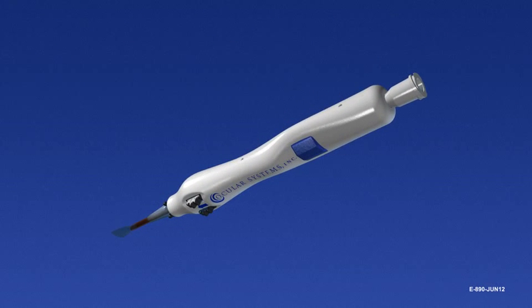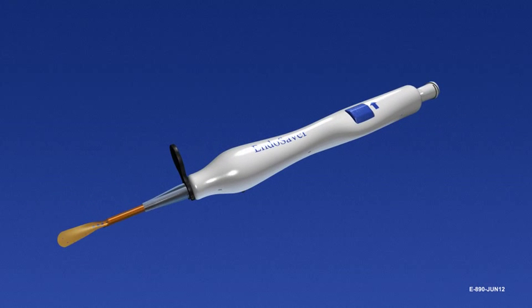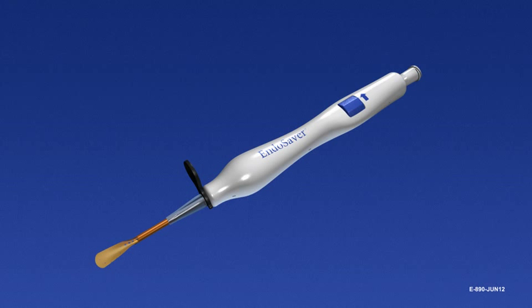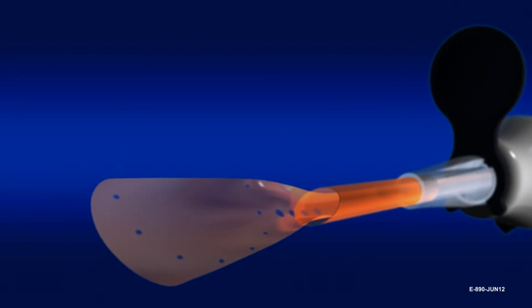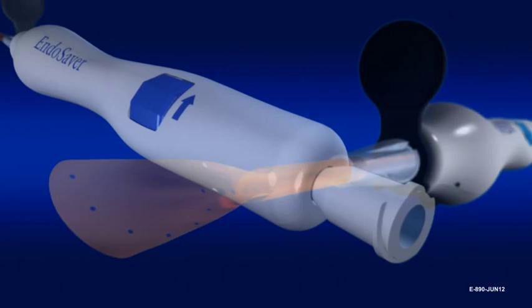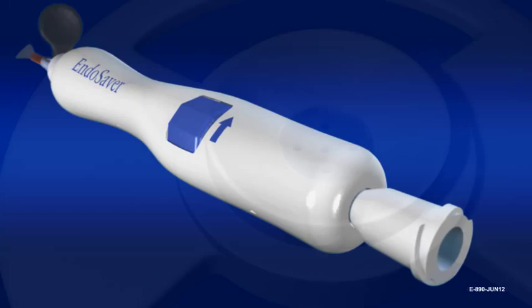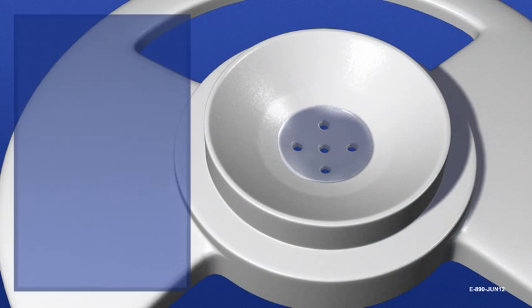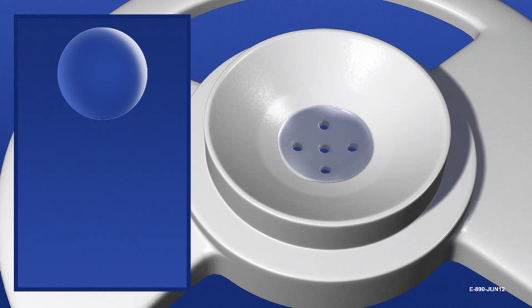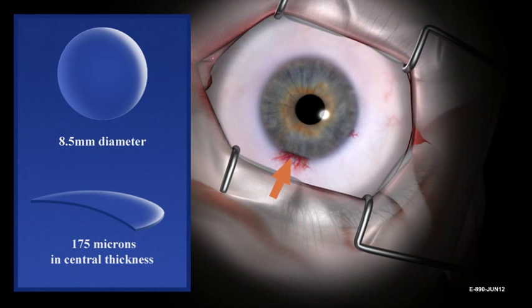The EndoSaver consists of the instrument's body, its internal mechanism, and carrier. It is a sterile, disposable, single-use-only device. When loaded with allograft tissue, rotated, and inserted into the eye, the allograft can be deployed in the anterior chamber. The EndoSaver is used to insert donor tissue measuring less than or equal to 8.5 millimeters in diameter and 175 microns in central thickness through a tight 4 millimeter incision.